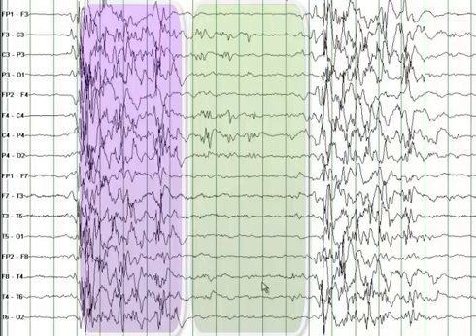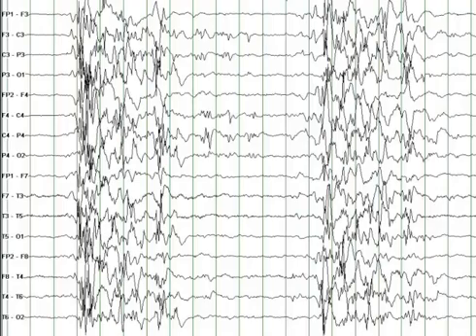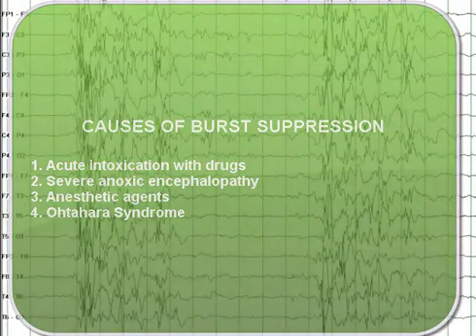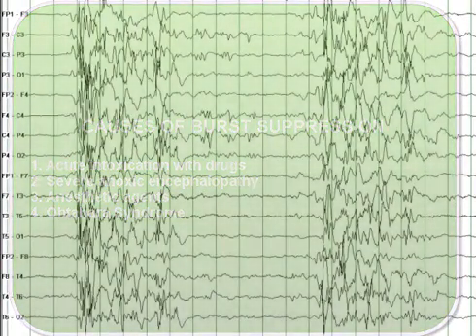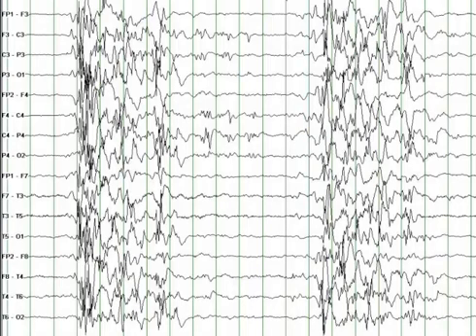This EEG pattern is called a burst suppression pattern. The burst suppression pattern can result from a number of different etiologies such as acute intoxication with medications, severe anoxic encephalopathy, effect of anesthesia, and one of the rare epileptic encephalopathies which is called Ohtahara syndrome.